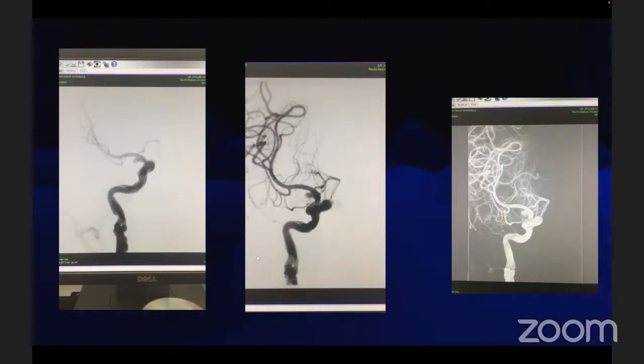We can see the two lumens, no? We went through the smaller lumen only, sir. We didn't preferentially go to that place, but whenever we tried to go through, we entered the smaller lumen only.